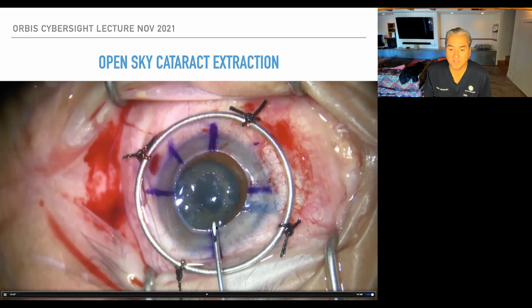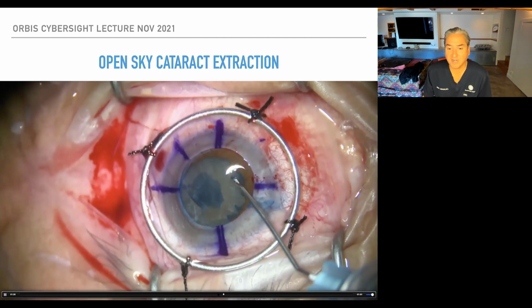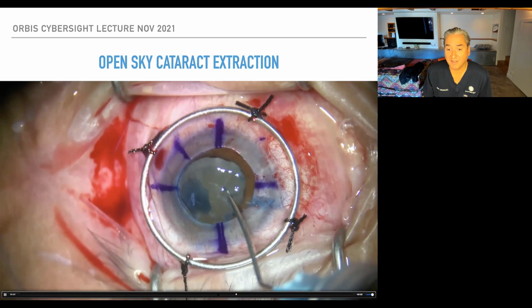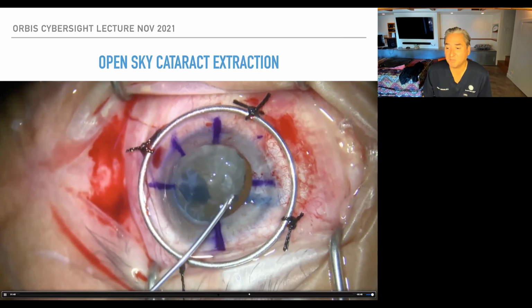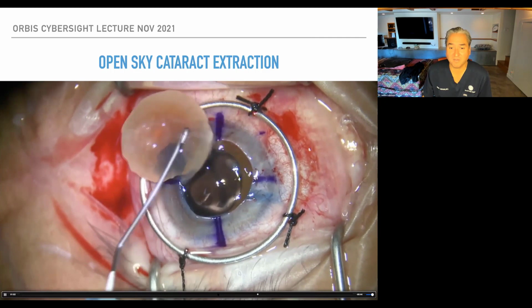And so then you remove this cap. And now you're going to use this cystotome to try to elevate the lens. Now this lens wants to come out. Even if they're big, they want to come out. And you don't have to have necessarily such a dilated pupil. So you kind of try to elevate one pole of the lens, and then you use the cystotome to kind of spin it out. And you can see that big old guy. Look at that. Holy moly.